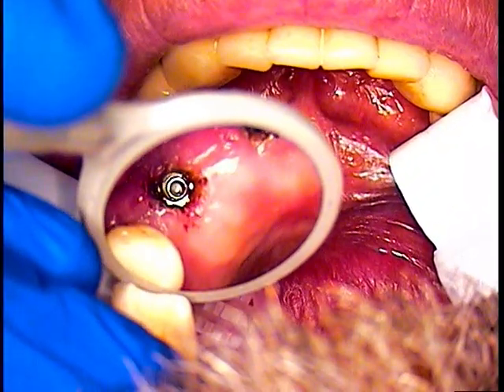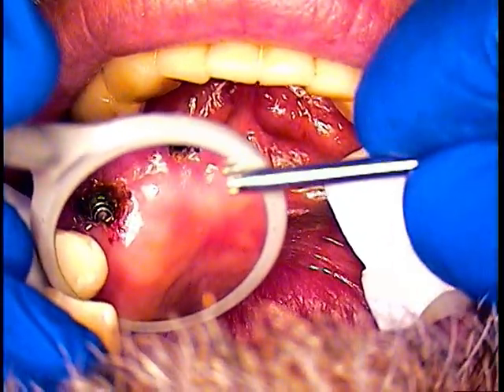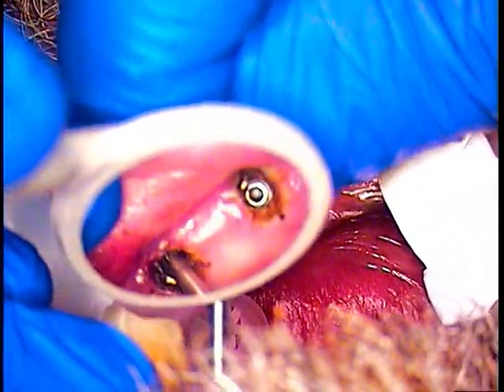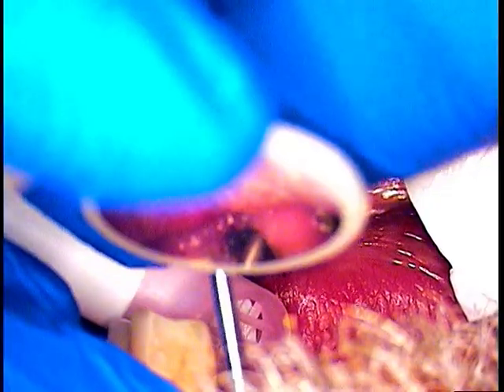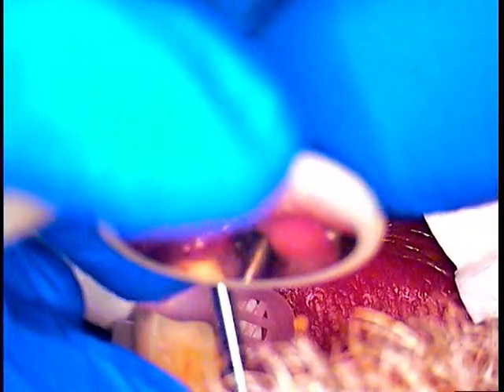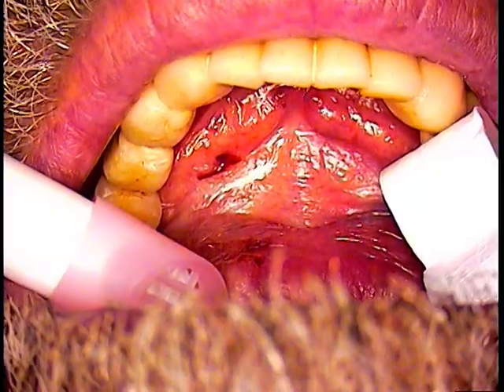Here we are now going after the fragment. This is a fragment fork. It's custom made. I'm going to let it sit at the top. I'm retracting his lip and going in at the right angle, straight in. That's the angle of the implant. I'm just going to rotate it gently. We know it's mobile, so we don't have any problem getting it out. Eventually it'll come out. It's about halfway out now.